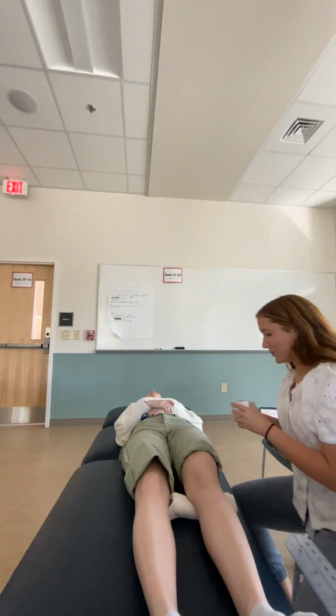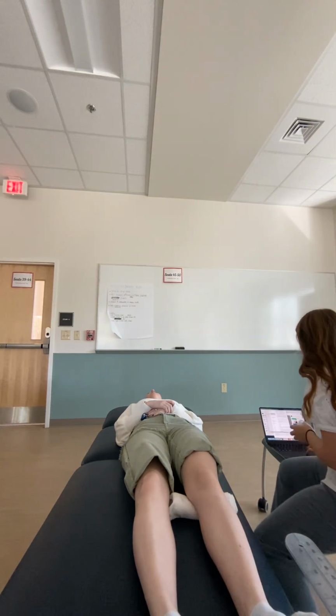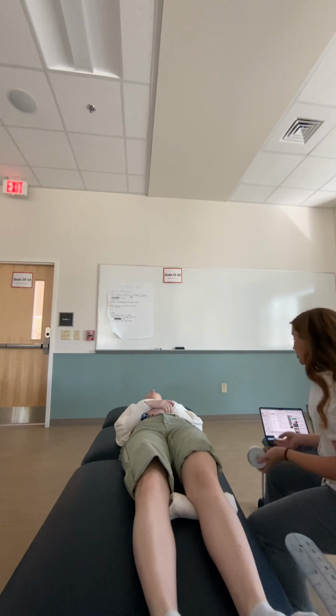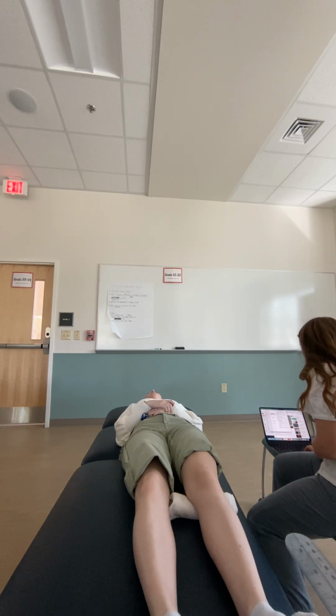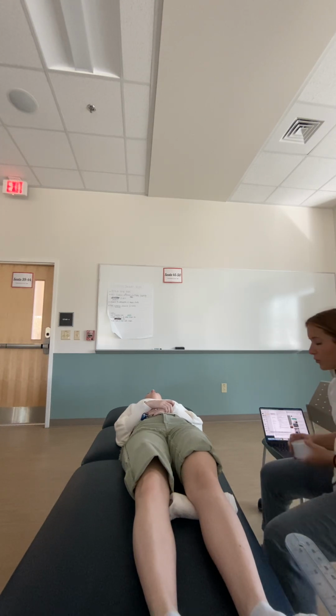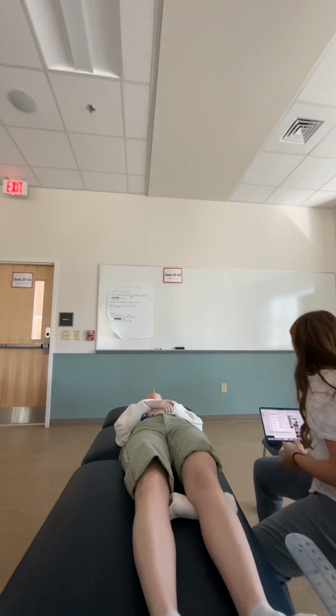Okay. Sorry, my camera's a little weird, so I'm gonna move it real fast. Okay, next we're gonna do what we call McConnell taping. And what that's gonna do is just help, hopefully, sometimes it works, sometimes it doesn't, it just depends on the patient. This is gonna help improve your patellar alignment and hopefully reduce your pain. Okay. So I'm just gonna have you remain in that relaxed position with your slight knee flexion. Okay. Your skin is clear and dry.